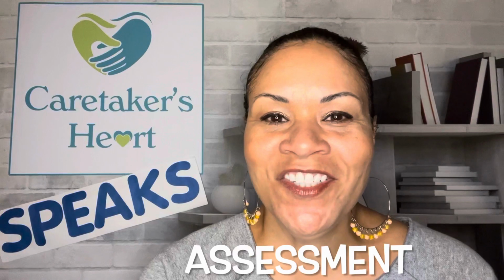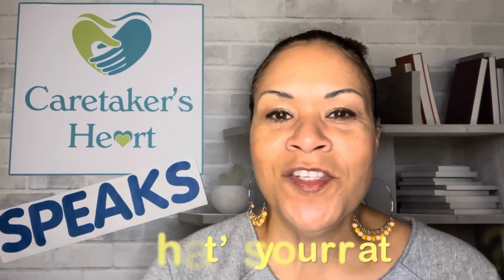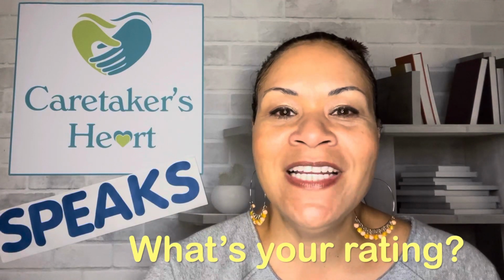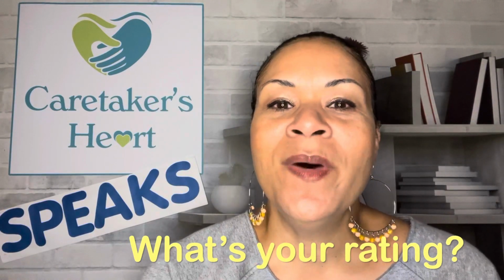And the last section is the assessment, and this will give you your BI-RADS rating. I'll be discussing those ratings in another video, but every mammogram is given a BI-RADS rating.